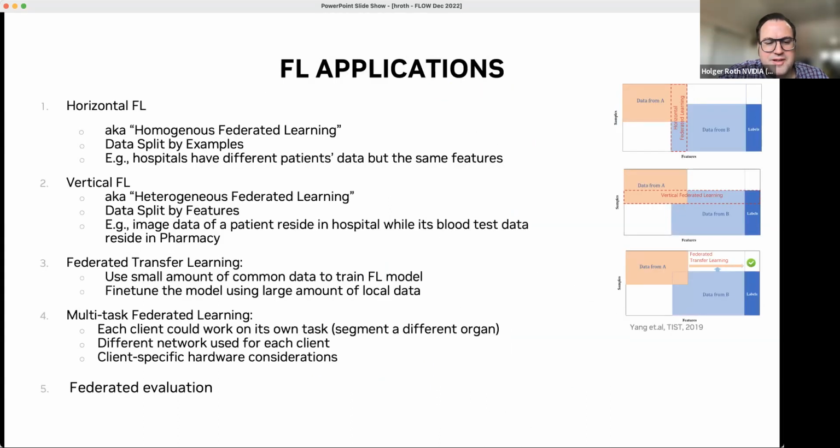I think most of the people in the audience are aware of these different types of applications, but federated learning encapsulates a wide scope of applications, with very many variations. In the classical vanilla federated averaging approach, we typically talk about horizontal federated learning, and that's also where we have done most of our work so far. It's basically assuming that each hospital has a similar data set. They could, in principle, all train their own model locally, and then these models are being averaged using the federated learning.